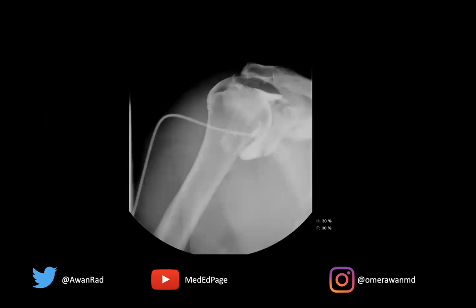If we scrutinize this case, first of all, this is a fluoroscopic image of a right shoulder arthrogram. We can see the needle coming in here — the tip of the needle is right here, pretty much at the rotator interval.